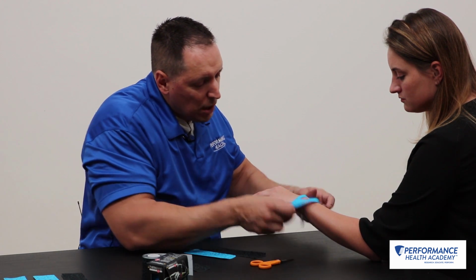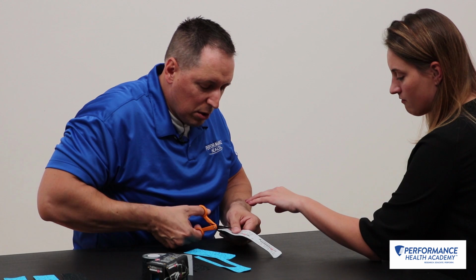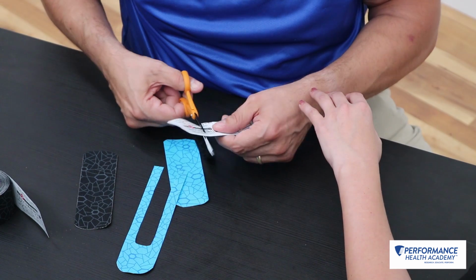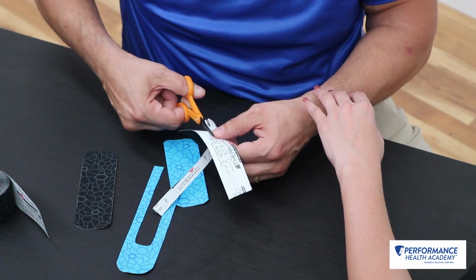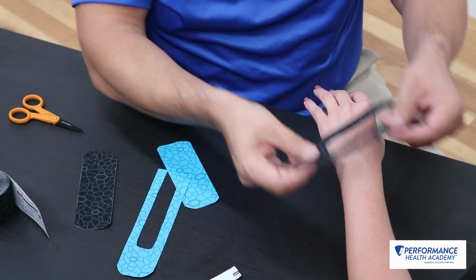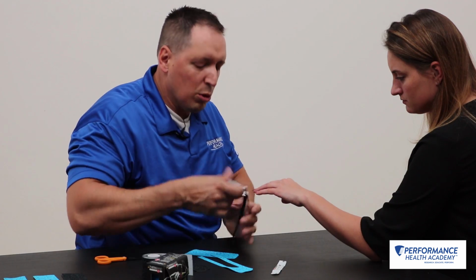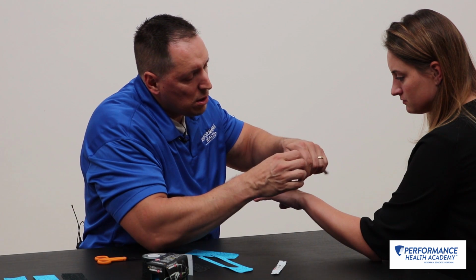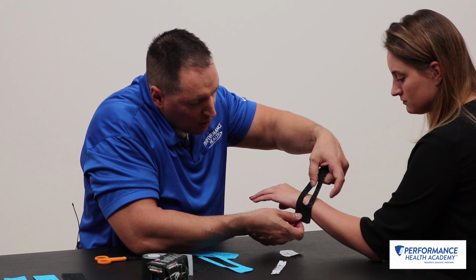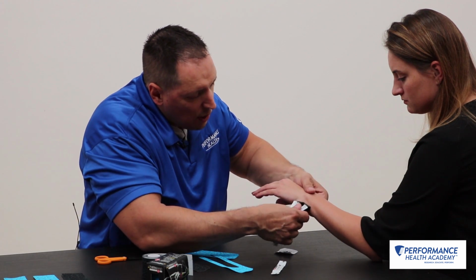the ulnar styloid. And so what you'll do is you'll do 2 4-centimeter anchors, do a 1 centimeter horseshoe cutout along either border here. This is where your starting point will be at this point. You'll break those straps. Lay that just inferior to the ECU tendon. No tension on those anchors.